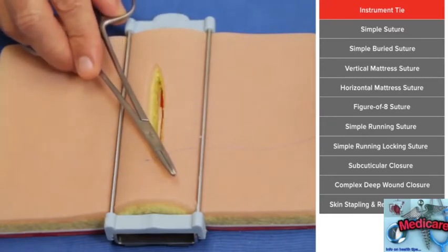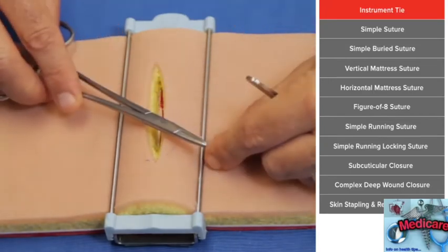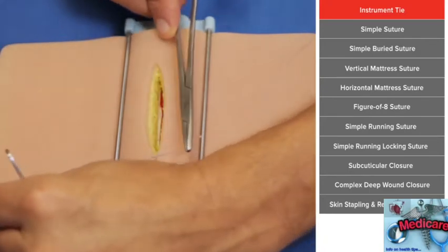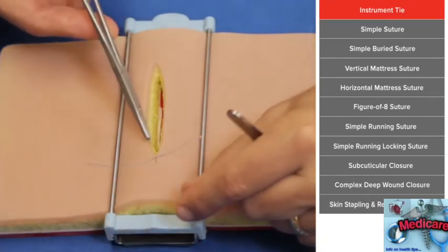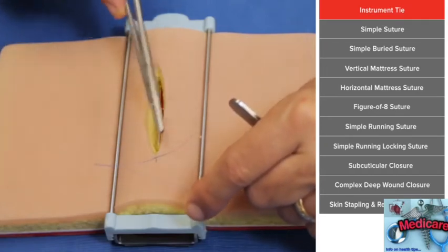You take your needle driver and you're just going to simply place it between the two. Take the long end and then wrap it. You want to wrap it twice. And then grab the short end and pull the short end across the wound to the other side. And what that does is it locks the wound down. See how it sits there and doesn't move.